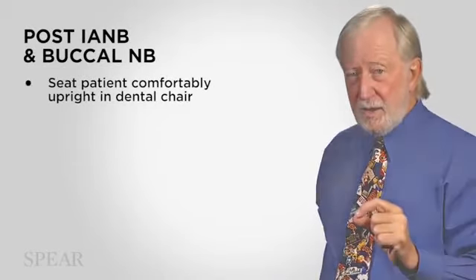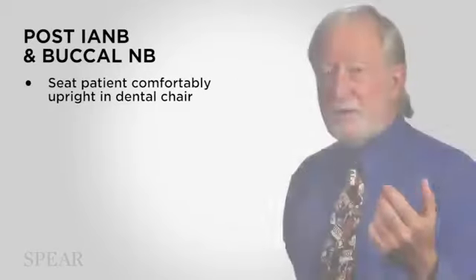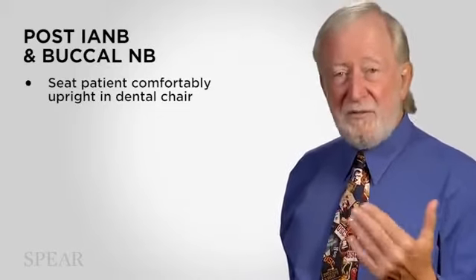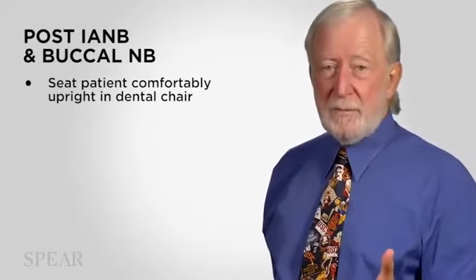All right, so once these 2 injections have been completed, what you should now do is seat the patient upright, comfortably upright. Now, there's an implication here. By saying you seat the patient upright after the injection is completed, I'm implying that your patient is lying down for the injection. And to me, that's very important. One of the subjects I also teach is medical emergencies. And the most common medical emergency seen in dentistry is fainting. Common garden variety fainting. Mr. Macho fainting. When? During an injection.